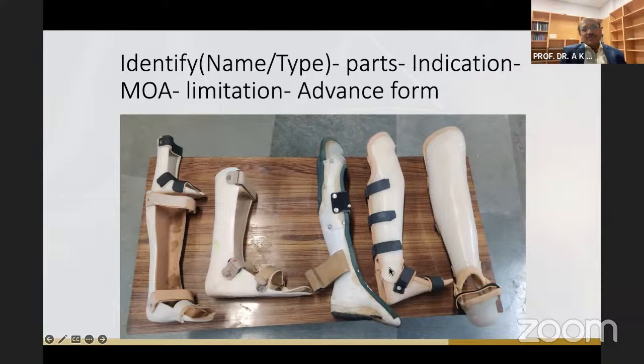And then there's another difference in this one. This also encompasses the foot and ankle, not the knee. In that sense, all these orthoses, this is a small miniature one, and this is a little bit larger one. Every orthosis that encompasses the foot and ankle, not the knee, has some specific characteristics. This one crosses just the malleoli. This one crosses far above. There is no joint at all here, whereas here there is a joint. Not only that, in this case there is a connecting bar in front.